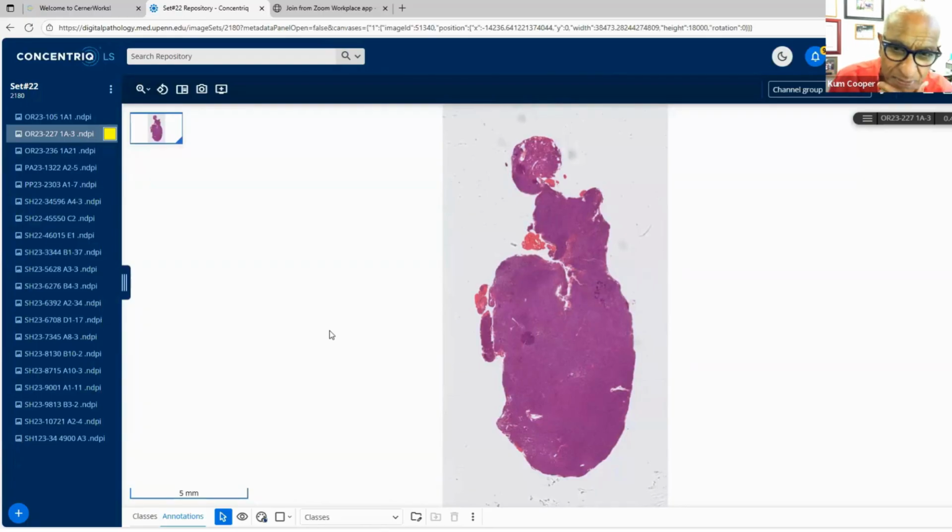And the same system is used every time. I show you a slide, I give you a history. These are all scanned slides from my own practice, and I share the morphology with you, and then you give me your differential or questions or investigations in the chat group, and I will try and answer as many as I can. So that seems to work most successfully, rather than unmuting and getting through that process. But the chat seems to work very well. So I have my chat open, and we can take that from there.